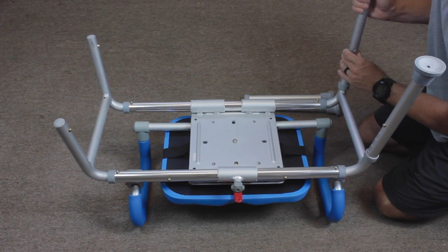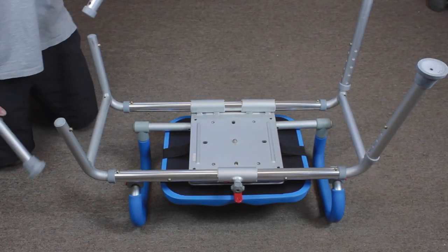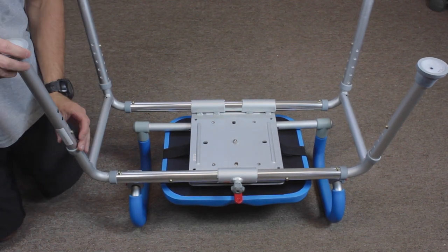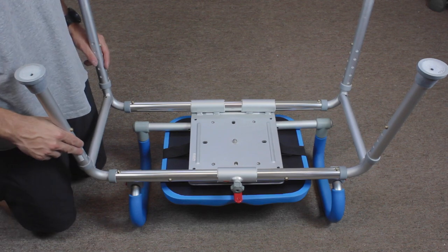Once you have all the legs in, you'll want to flip the chair over and ensure that the chair is level. Once it's level, we can move on to installing the backrest.